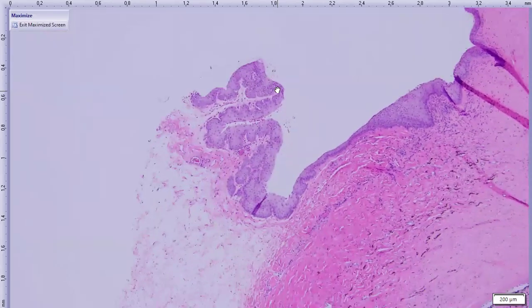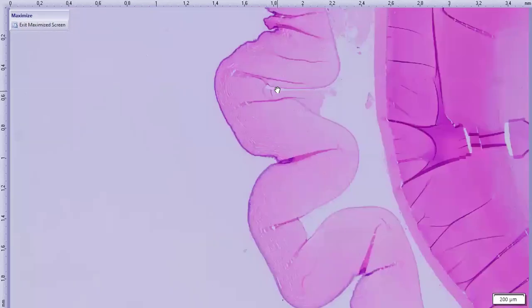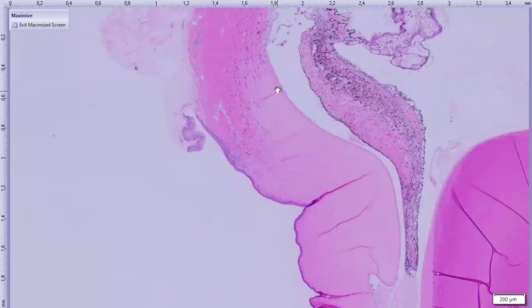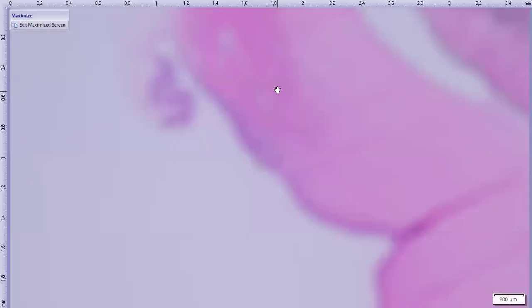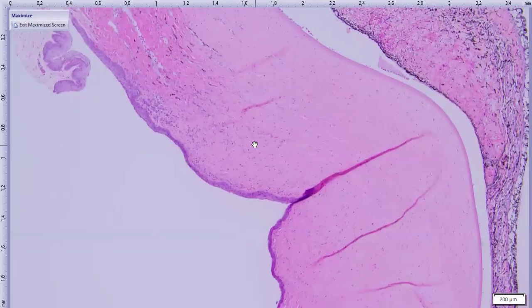Kind of a secondary lesion from that can also be caused from exposure, although we didn't think that the globe was exophthalmic in this case. And then moving back to our globe, again, like I said, the perforation was kind of paraxial, so it was not sampled in our DV cut. Again, we can see our squamous metaplasia in our conjunctival epithelium. A little bit of inflammation, a couple blood vessels coming into the peripheral cornea. Got a little bit of edema fluid.